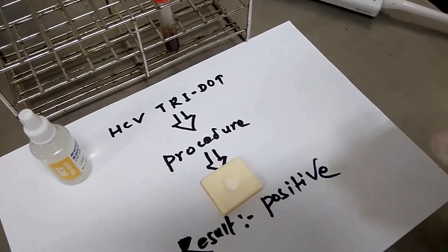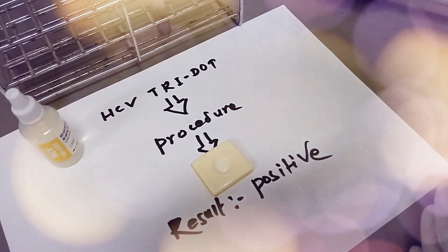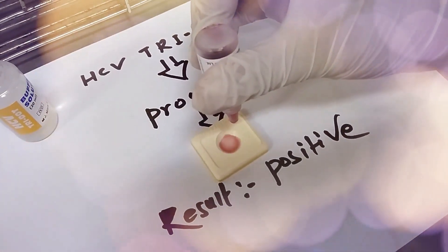Then free falling 2 drops conjugate and leave for drying.